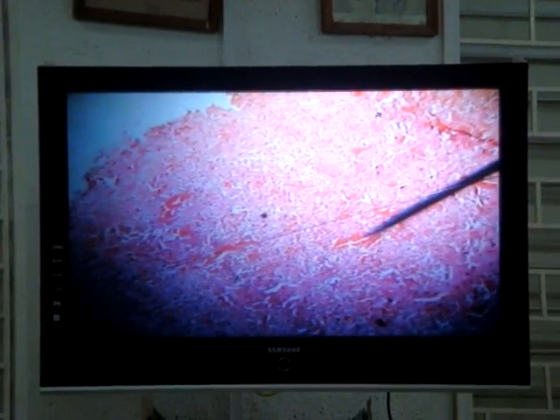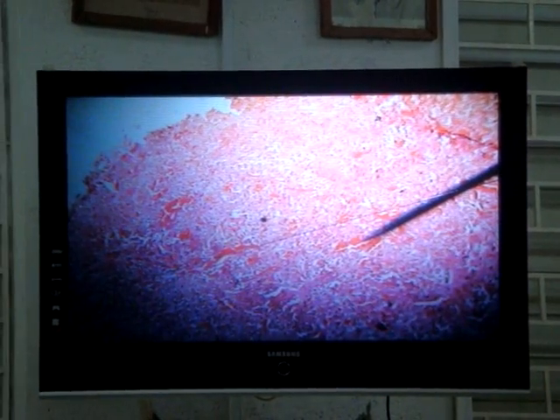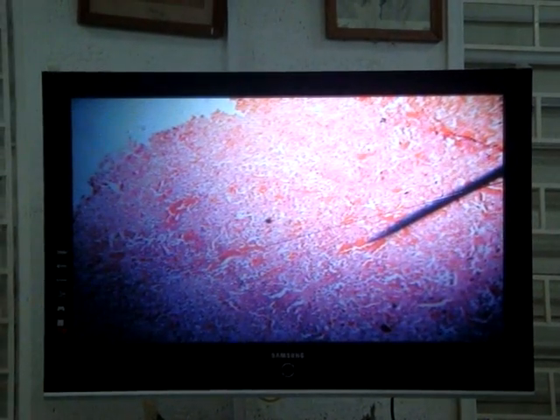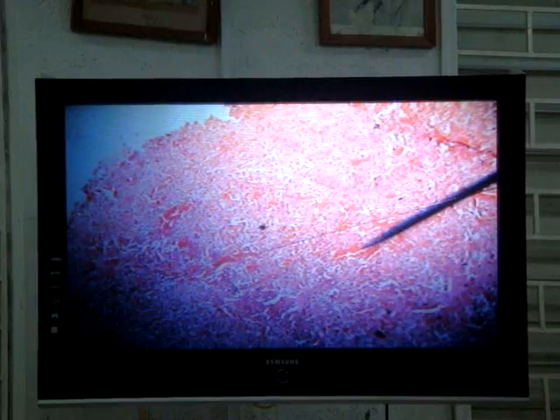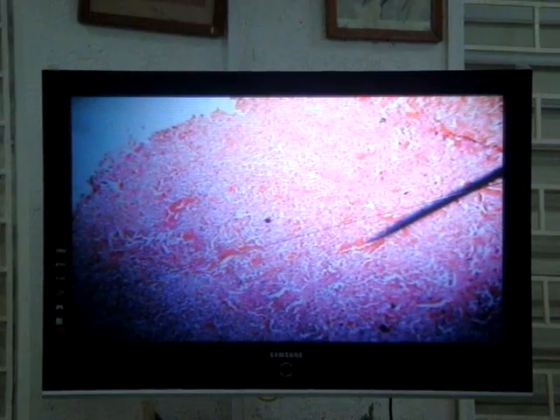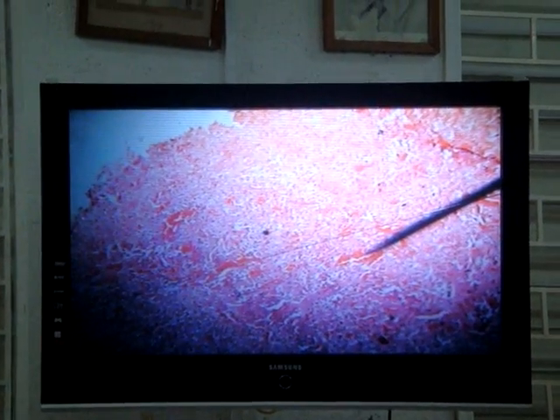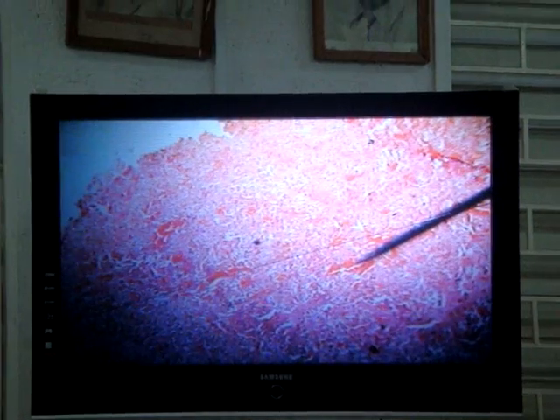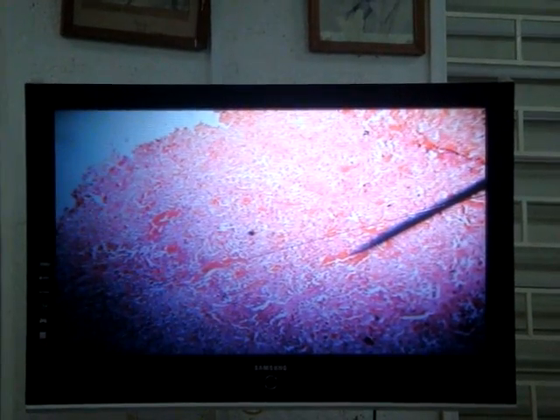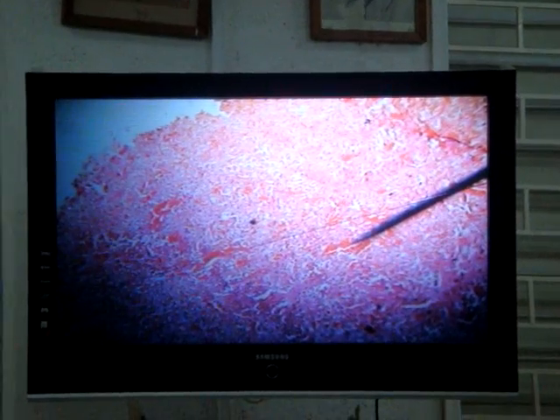All right, now also note the preponderance of these pinkish areas. These areas represent capillaries. And so now you understand and appreciate that the pituitary, being an endocrine organ, will be very vascular. These capillaries are fenestrated. So the pituitary gland is highly vascular due to these numerous capillaries, and these capillaries are fenestrated.